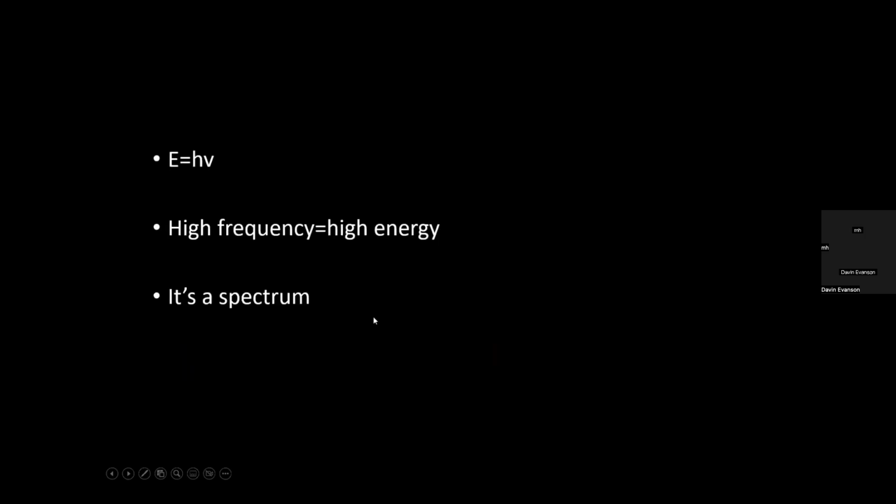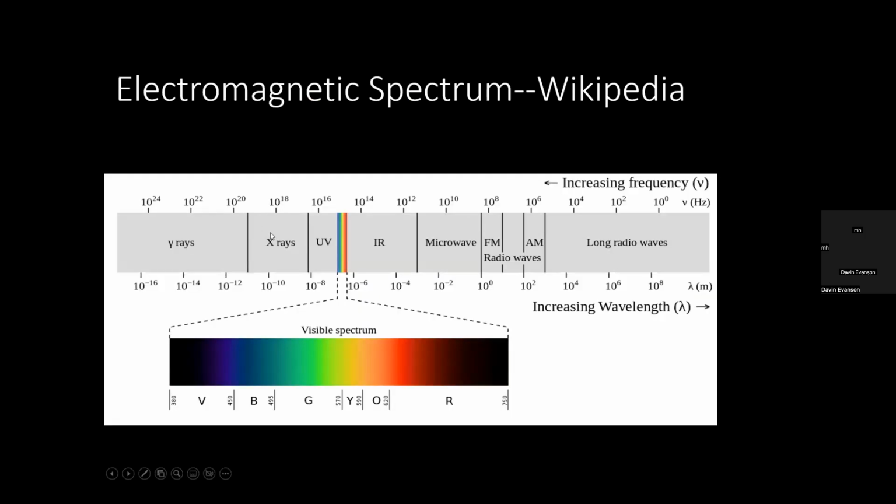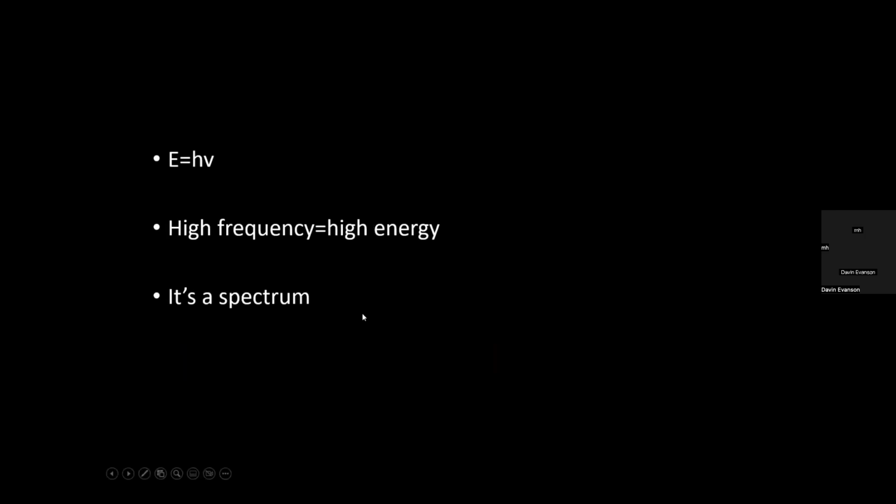And I promise this is the only physics-y type of slide. Planck's equation, E equals hv, Planck's constant times frequency. So if you have a high frequency, it's directly proportional to energy. So high frequency equals high energy. Again, there are X-rays and gamma rays. Then also notice that X-rays are a spectrum. Not all X-rays are created equal. So if we're going to do a radiology study on a baby, we will use the lower energy X-rays versus if we're trying to penetrate a bariatric patient, we have to ramp up the voltage, use our higher energy X-rays to penetrate the patient. So that's some basics from physics.